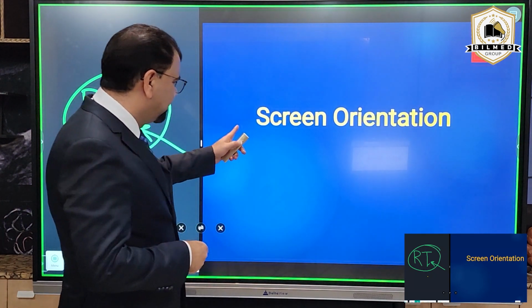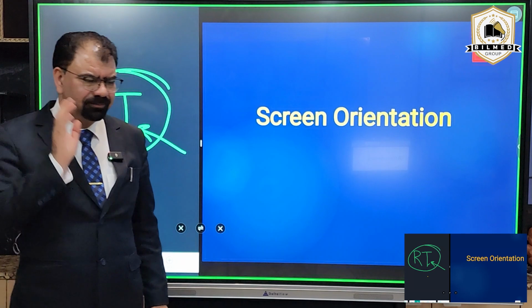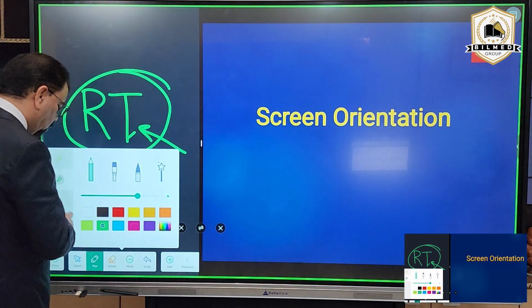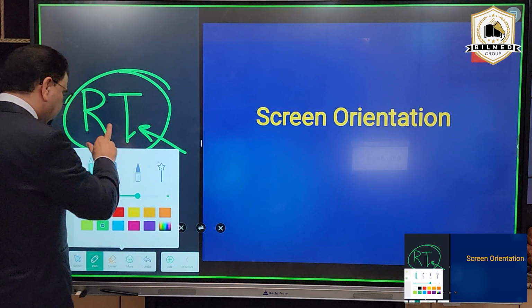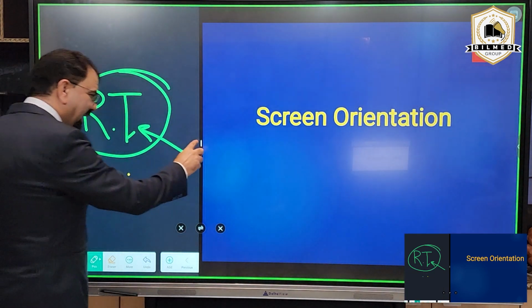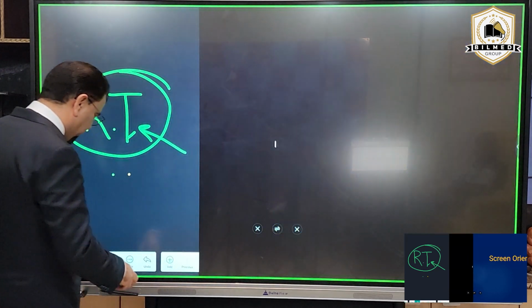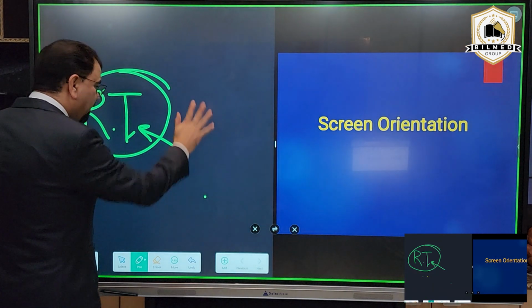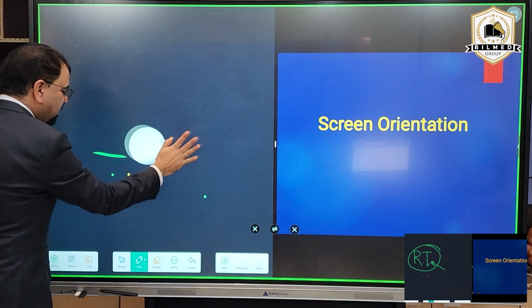Are you clear with the screen orientation, Dr. Madhuri? Tell me. Yes, yes, sir. Yes or no? Yes, sir. Okay. Now let us take a quick recap of this screen orientation, and let us see if we are clear about it.